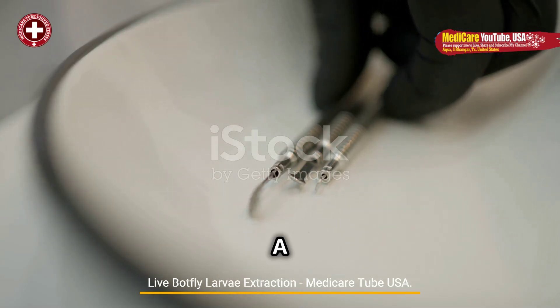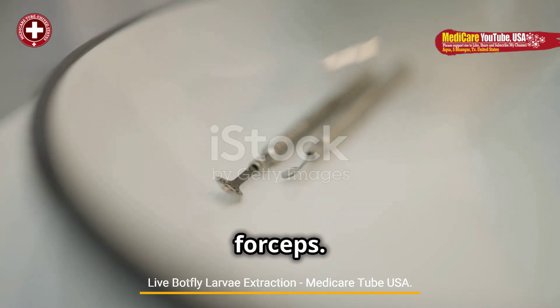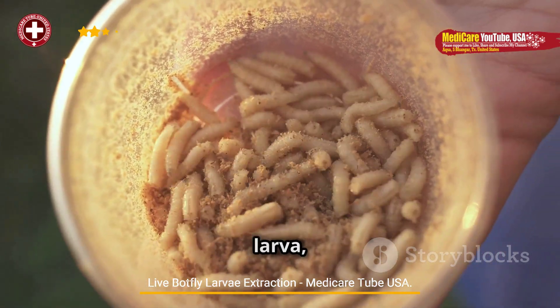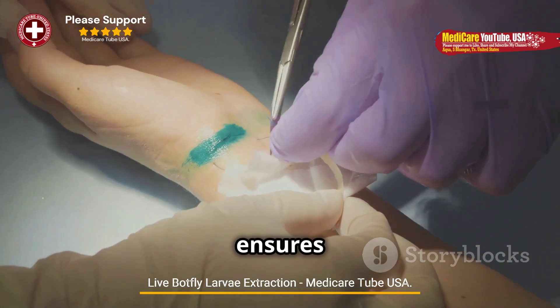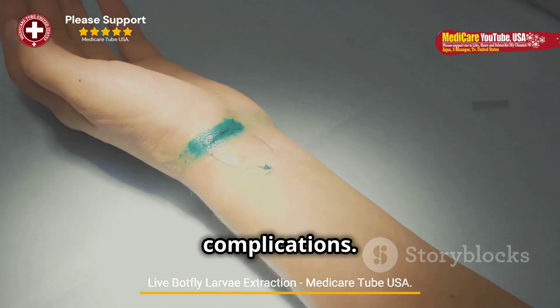Manual extraction. A firm grip is taken on the visible part of the larva using sterile forceps. Gentle, consistent pulling is applied to avoid breaking the larva, as leftover parts can lead to infection or inflammation. Extreme care ensures the larva is removed intact, as rupturing it can cause secondary complications.